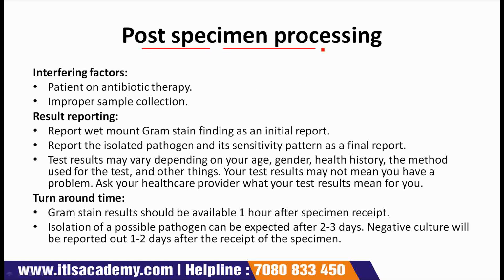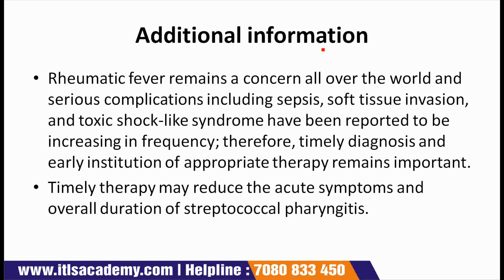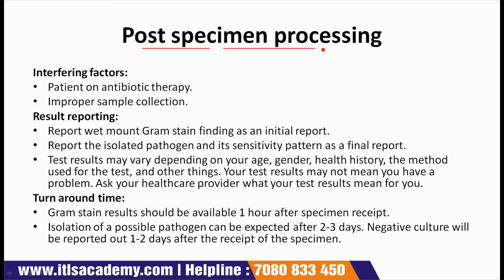Post specimen processing. Interfering factors. Interfering factors are patient on antibiotic therapy and improper sample collection.